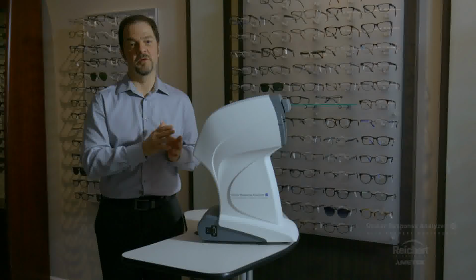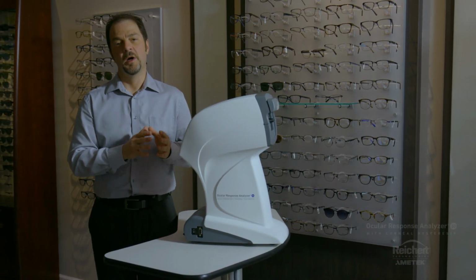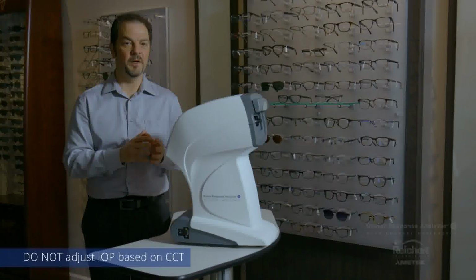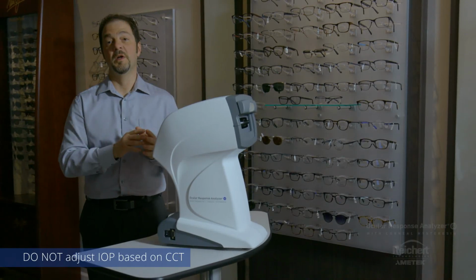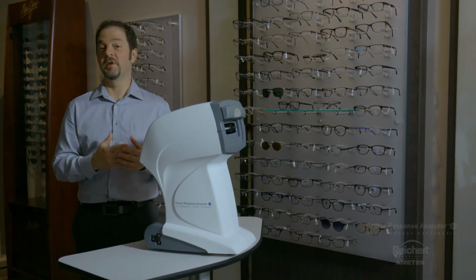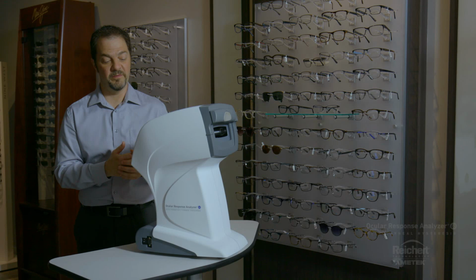Or some practitioners take the IOP measurement and try to adjust it for corneal thickness. Adjusting pressure for corneal thickness has been discredited, shouldn't be done. If your EMR software does this, you want to make sure that you somehow disable that function because IOP-CC is already compensated for corneal properties.